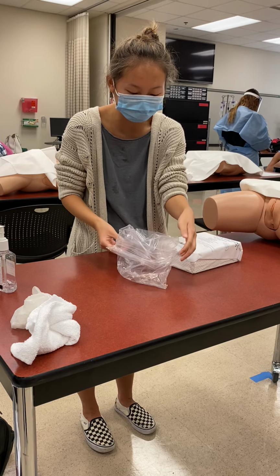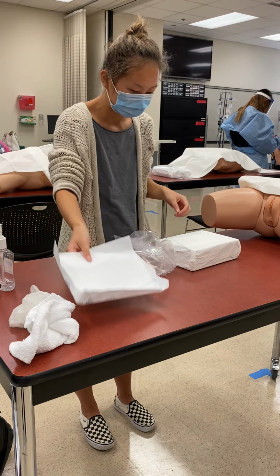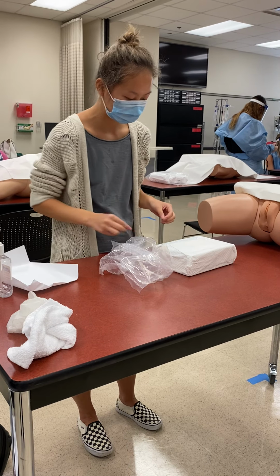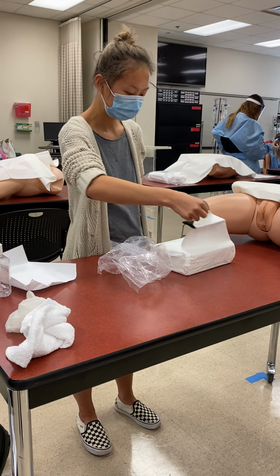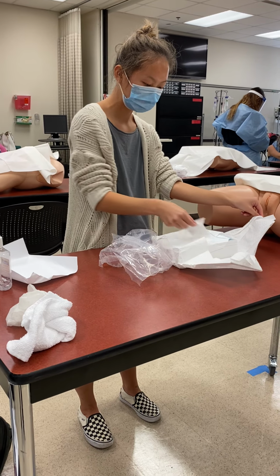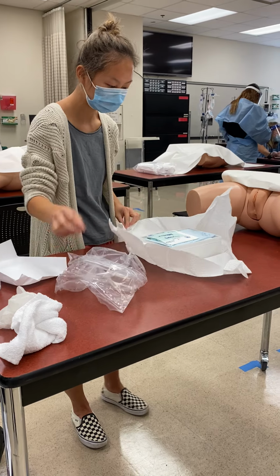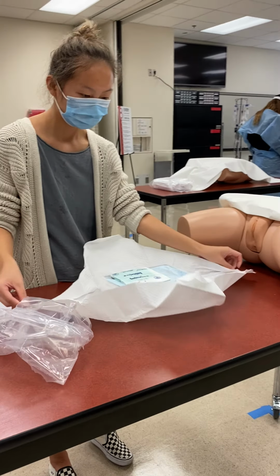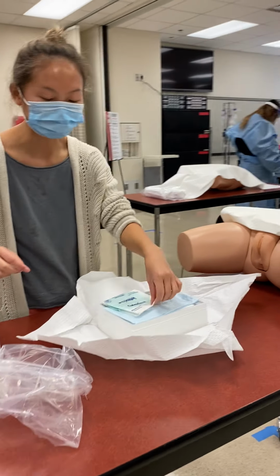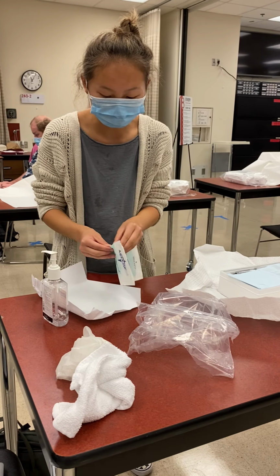So we're going to just put this at the end of the patient's bed here. And so now I want to put on my sterile gloves for the procedure. So I would do this off to the side over here.